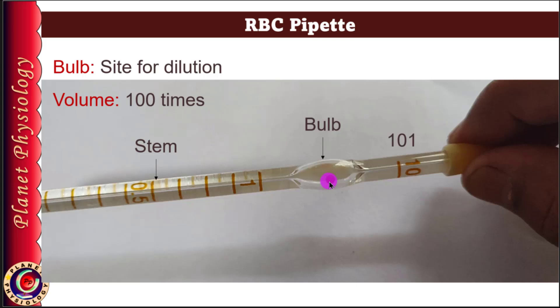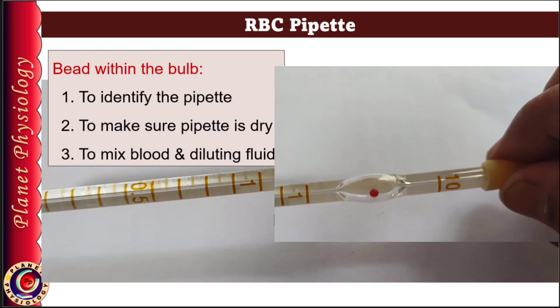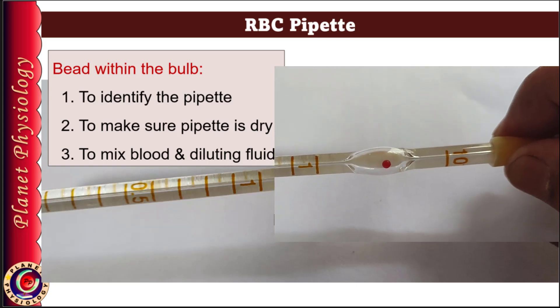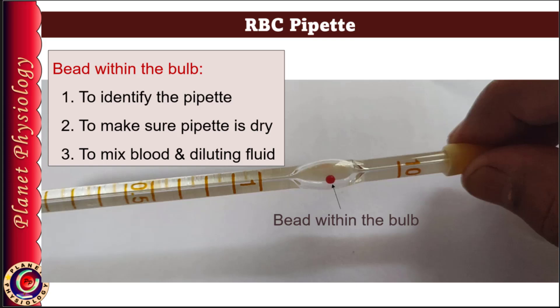The bulb has a small red-colored bead within it, which serves three important purposes. First, identification of the pipette — the RBC pipette always has a red-colored bead. Second, it acts as a dryness indicator. As you can see, the bead moves freely within the bulb when the pipette is tilted. This movement indicates the pipette is dry, which is crucial before starting to collect the blood sample. If the pipette is wet, the bead will stick to the wall of the bulb and will not move freely. The third function of the bead is to mix the contents — the blood sample and diluting fluid — ensuring an even distribution of cells for counting.